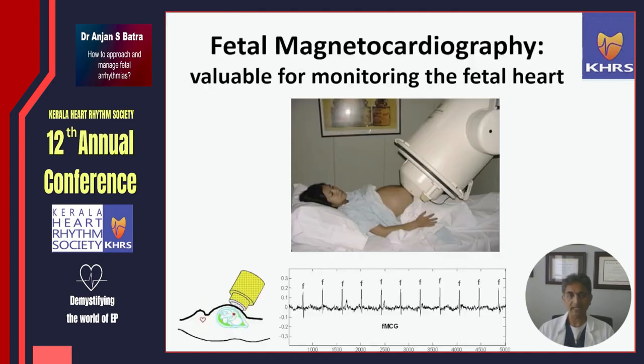Fetal magnetocardiography. Many of you folks may have heard of this. It can be a valuable tool for monitoring fetal heart rates, and it is the closest thing we have to a fetal ECG. However, as you can see in the picture, it is a bulky and a very expensive tool which only very few centers in the United States have.